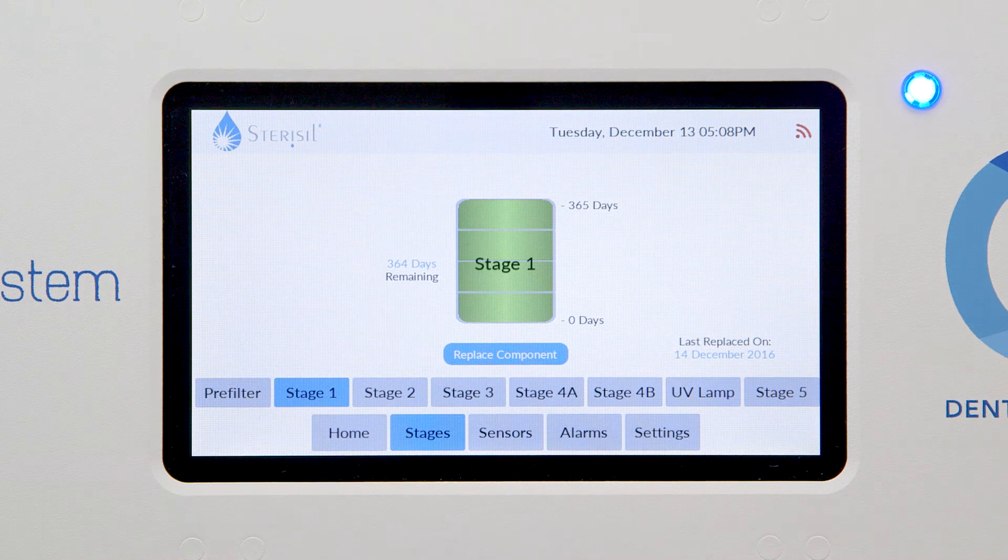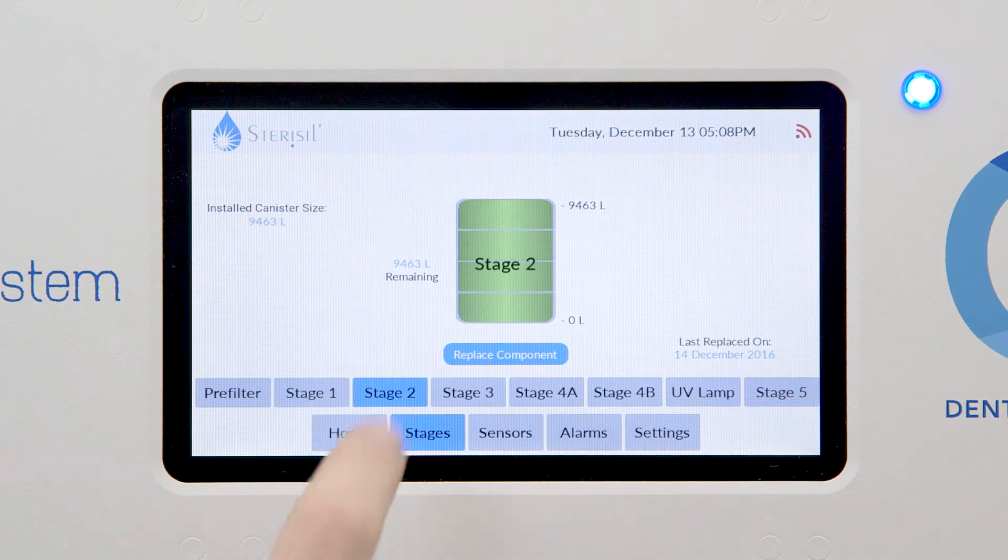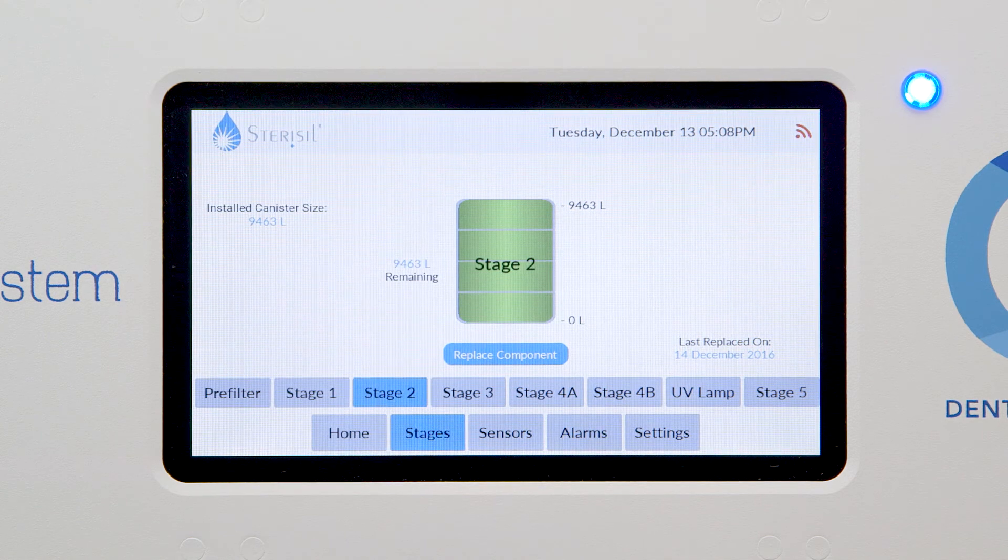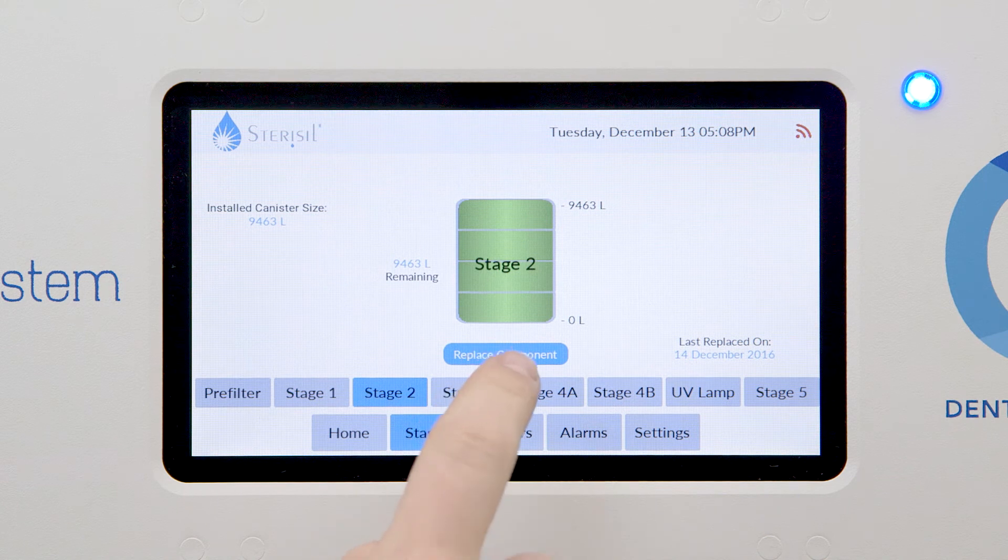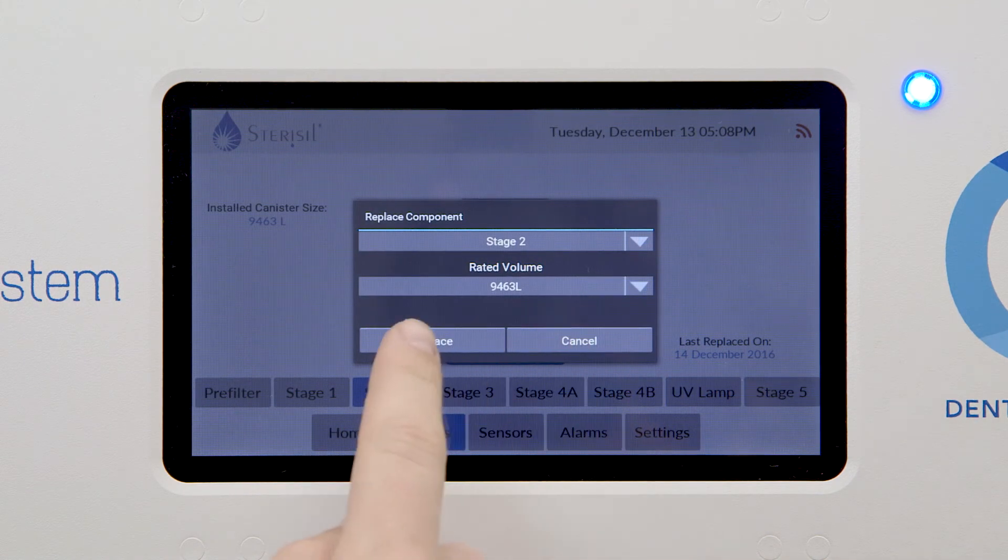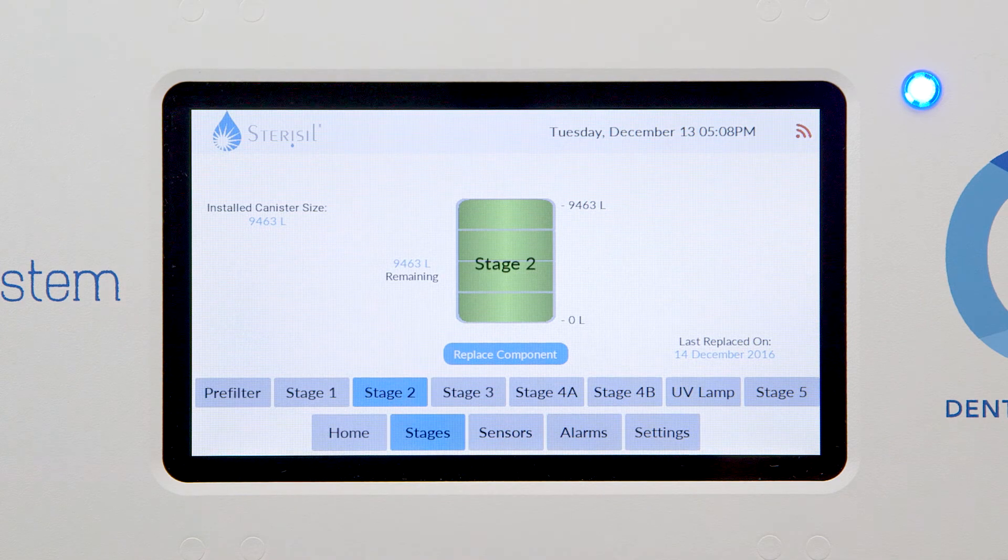Stage 2's lifespan is based on liters processed and is effective up to 9,463 liters. If the counter is not reading 9,463 liters, you'll select Replace Component. Choose Stage 2 from the drop-down menu and touch Replace.